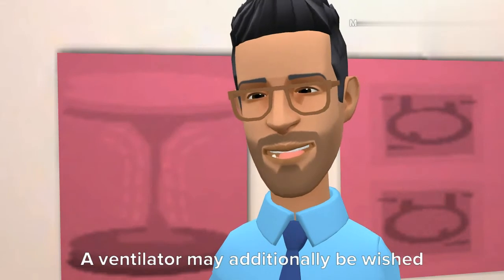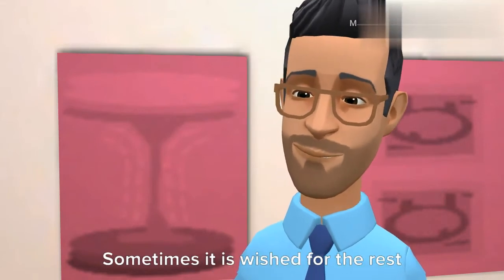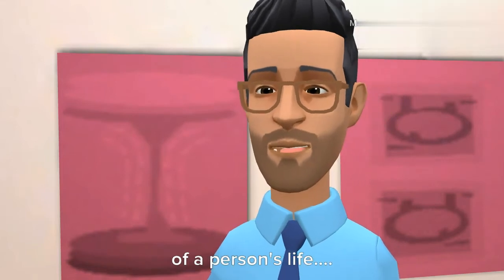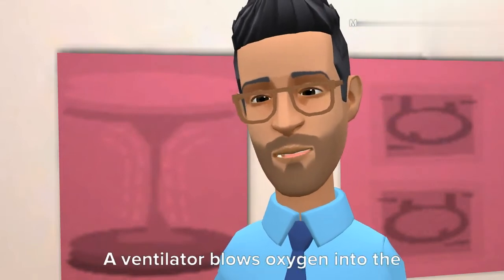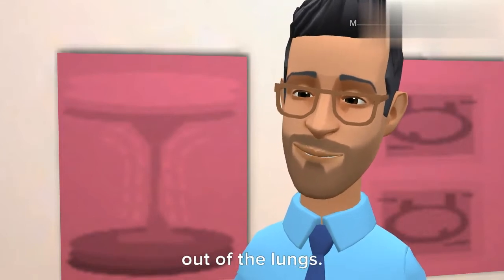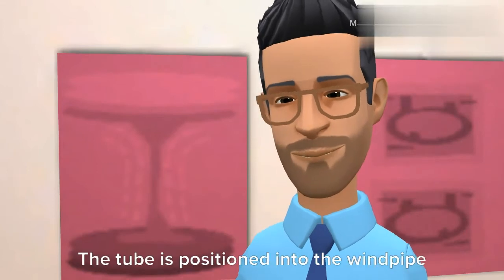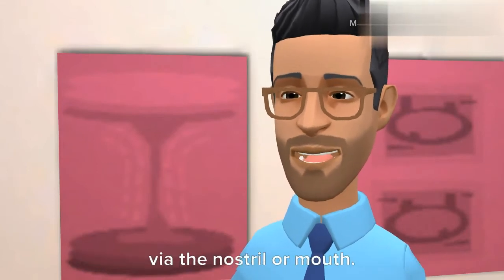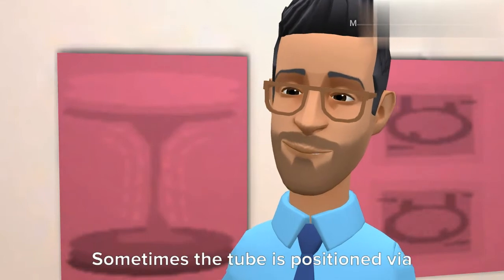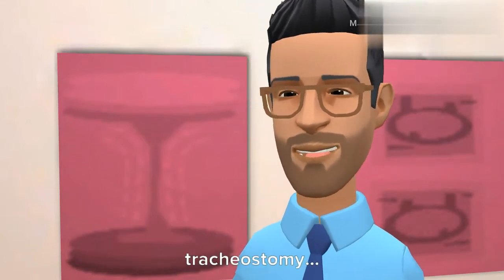A ventilator may be needed for a few hours, weeks, or months. Sometimes it is needed for the rest of a person's life. A ventilator blows oxygen into the lungs and gets rid of carbon dioxide out of the lungs. The ventilator is connected to a breathing tube at one end. The tube is placed into the windpipe via the nostril or mouth. Sometimes the tube is placed via a hole in the neck called a tracheostomy.